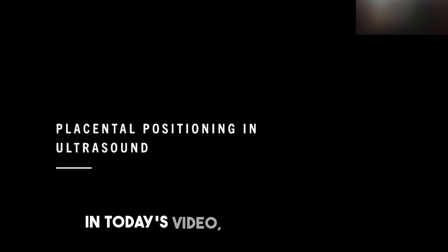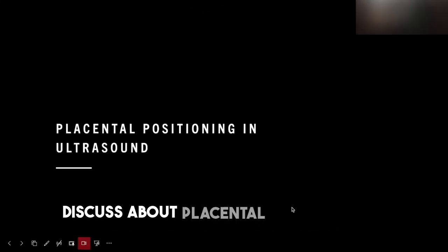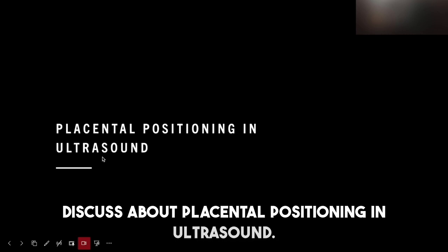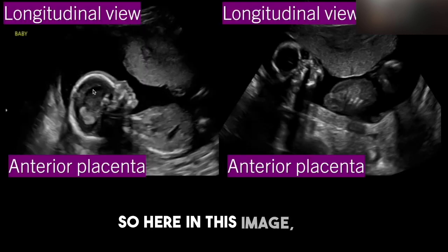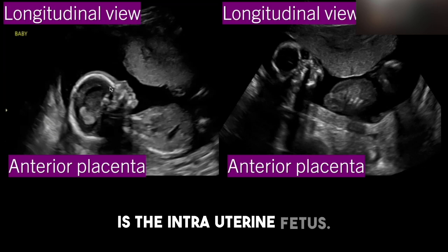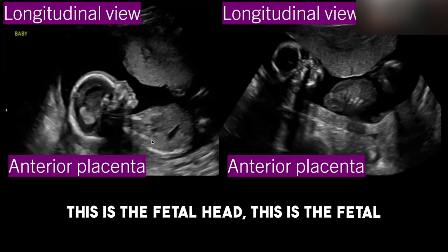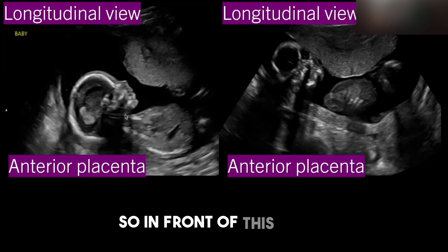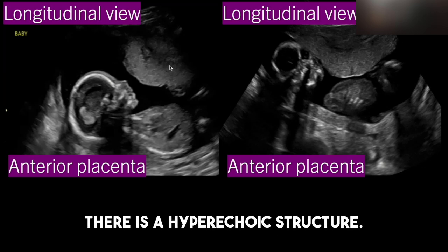Hello everyone. In today's video we are going to discuss about placental positioning in ultrasound. Here in this image, this is the inter-uterine fetus, this is the fetal head, this is the fetal body. So in front of this fetus, there is a hyperechoic structure.